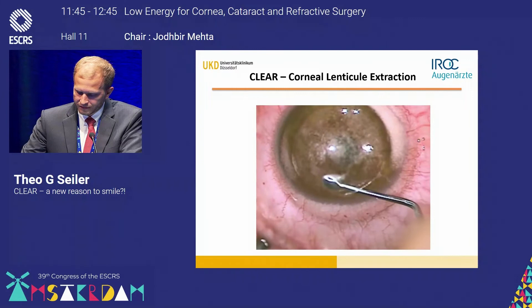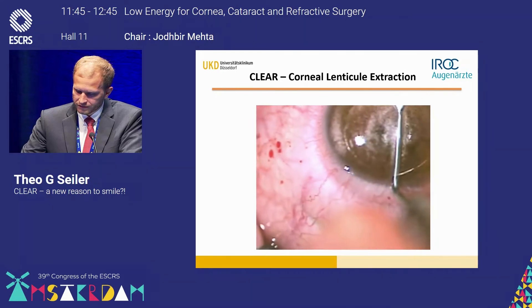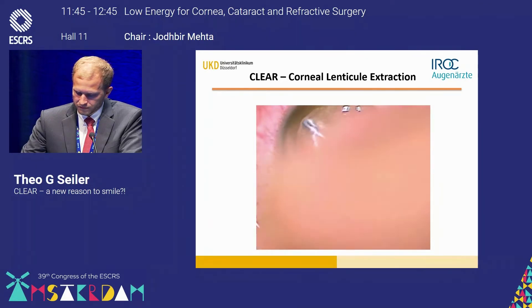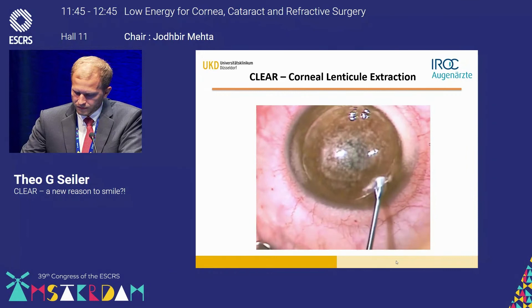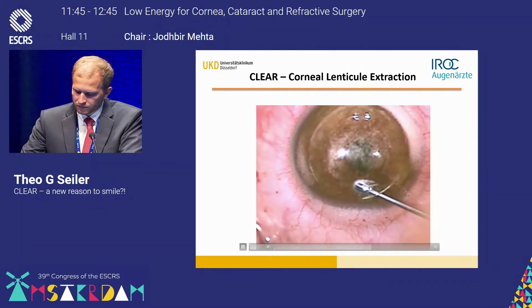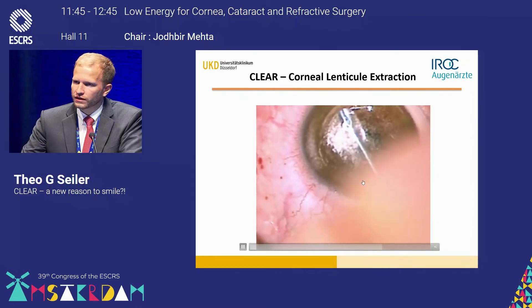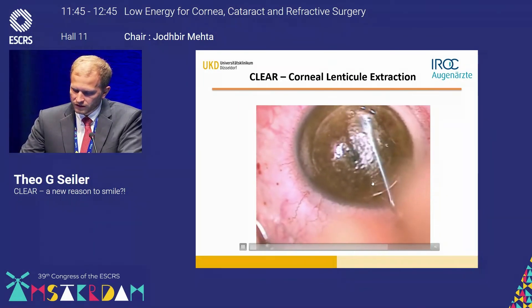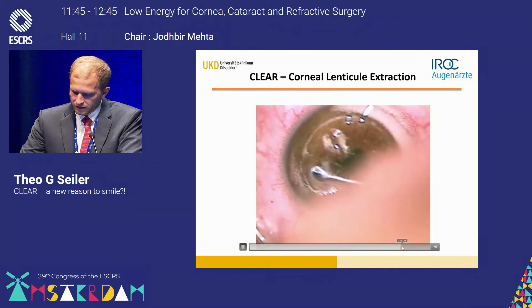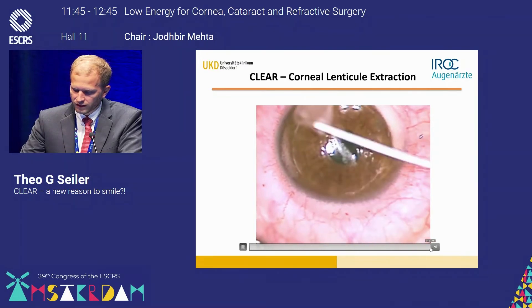Now preparing the anterior plane — the dissection goes quite smoothly with not many bridges. Then going into the posterior plane, you can see that the margin of the lenticule is anterior to the dissector, which is another benefit of the well-defined lenticule margin. I prepare it and in the end, slightly sped up, you just take it out and double-check that the lenticule has been removed in total.